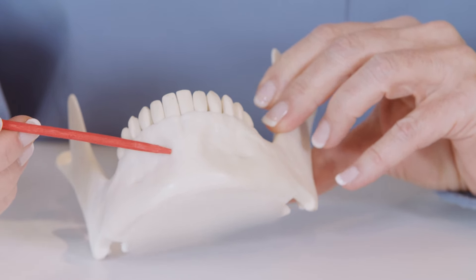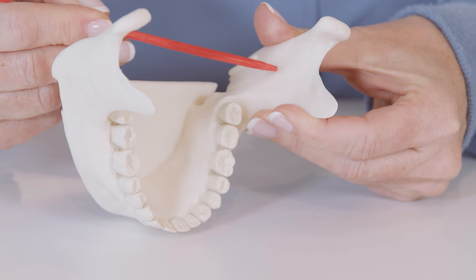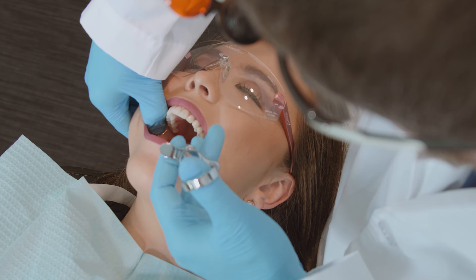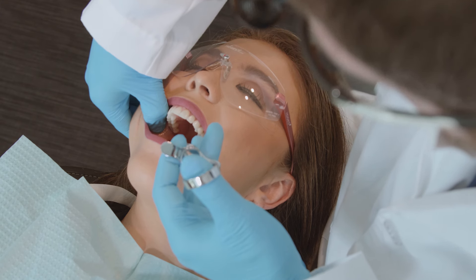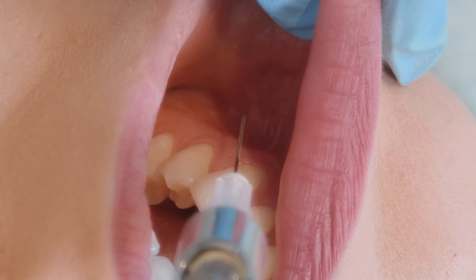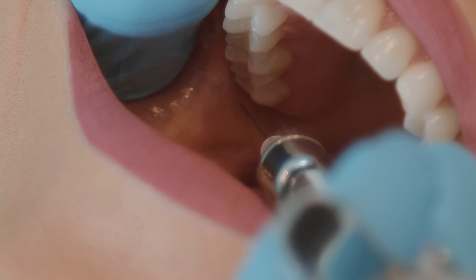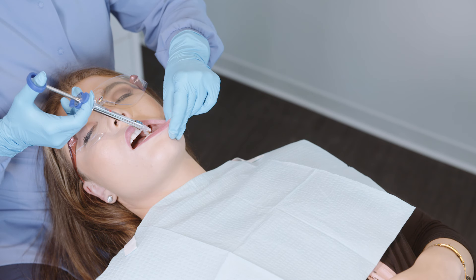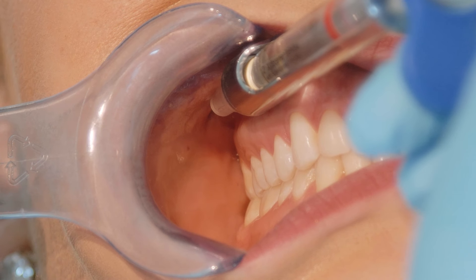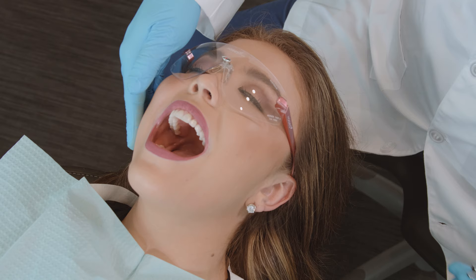However, the inferior alveolar nerve is accessible before it enters the body of the ramus through the mandibular foramen. Deposition of local anesthesia in this area will produce conduction blockade. In this program, we will examine the most commonly used injection techniques for mandibular anesthesia. Our goal is to increase your success in achieving profound anesthesia of the mandible. Local anesthetics are among the most effective drugs available — if deposited near peripheral nerves, they will produce reliable and predictable anesthesia. Mastery of clinical anesthetic technique rests upon a solid understanding of anatomy.